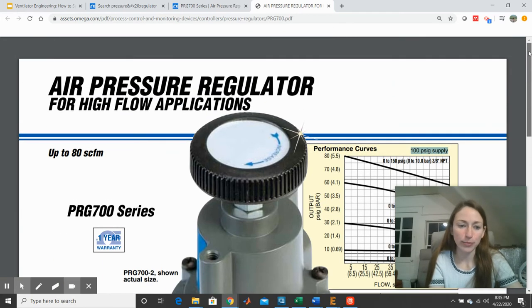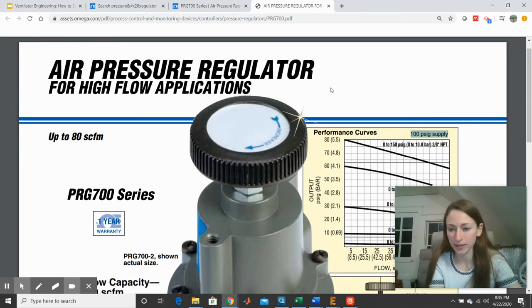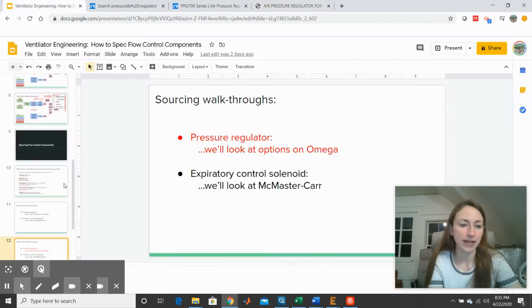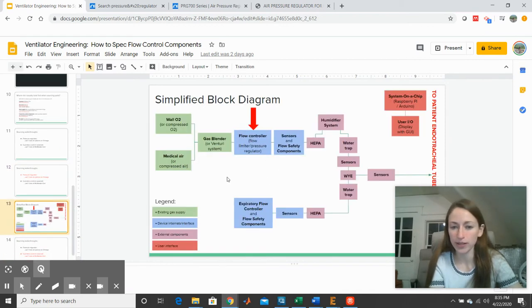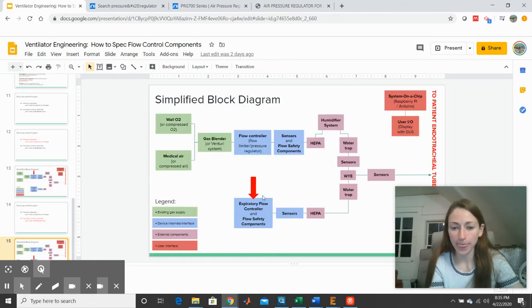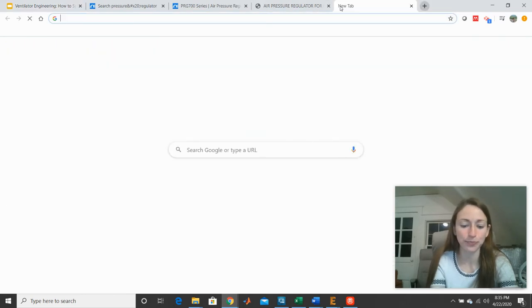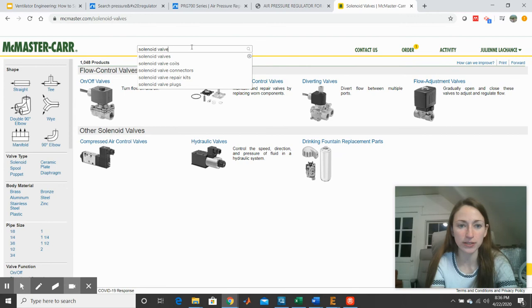Okay, so I'm pretty happy that this regulator would work on that inspiratory block from our diagram. That's this guy. Okay, so having found a reasonable candidate for that, I'm going to start looking into the expiratory control solenoid. And for this part, I'm going to go to McMaster-Carr and see what we can find there. I'm going to go to mcmaster.com and search for solenoid valves.